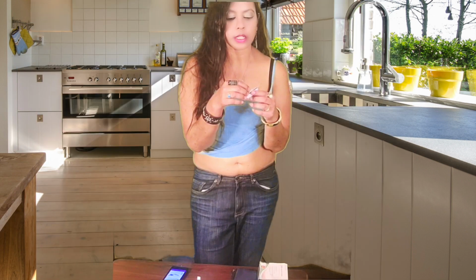So now, without getting your fingers on this, just take off the flaps here. Anybody see it? Okay, so I'm just taking off the flaps. Very important not to get your finger on the sticky part. I'm holding the part on the other side. Okay, so now I put the wipe here. I decided my side, okay?